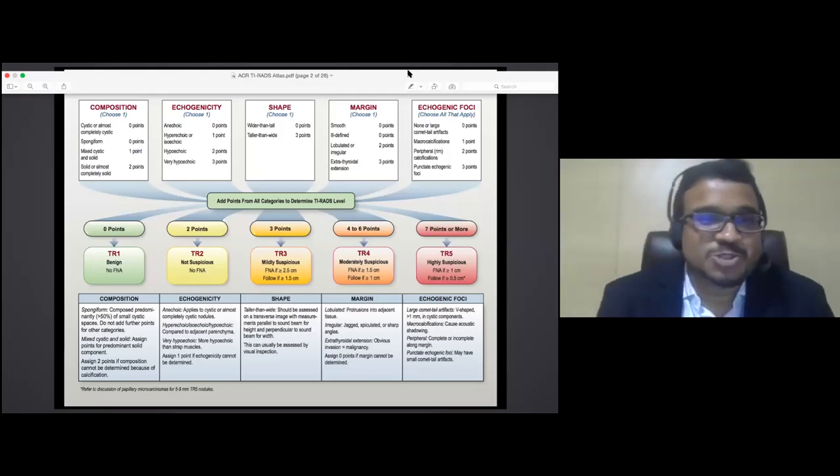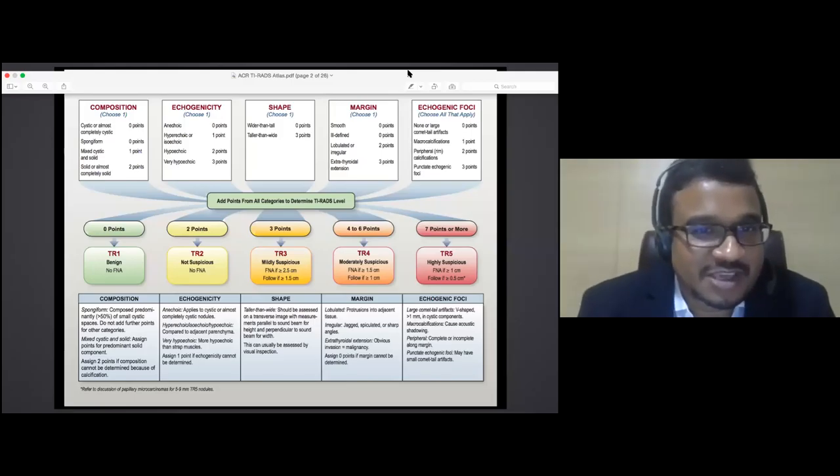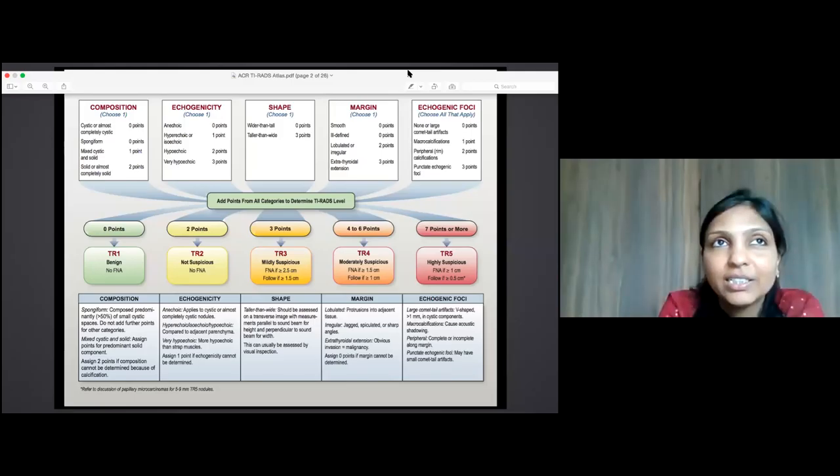And also about the posterior acoustic shadowing, if you could say. Suppose there is a denser material, for example the trachea. A large portion of the ultrasound waves are going to reflect off a denser material, like cartilage or a bone. So anything posterior to that will have signal dampening. There essentially would not be any transmission of the sound waves, which gives you this shadowing, the darkness right behind a brighter spot. Okay, thank you.